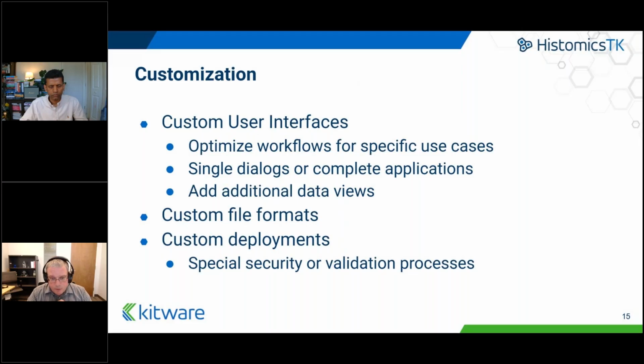We can customize the file formats, as I mentioned, image formats, but we've also done things where we've integrated, hey, I've got an Excel spreadsheet with some data. I'd like to view that in line immediately adjacent to my image.